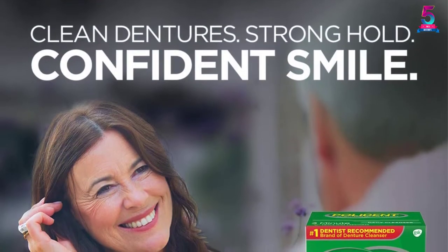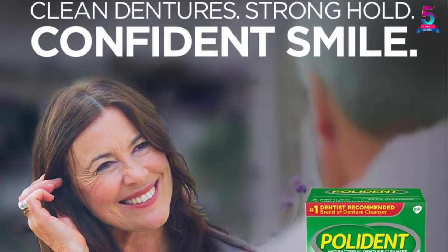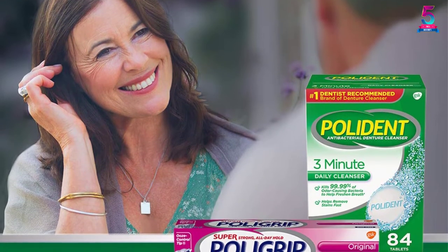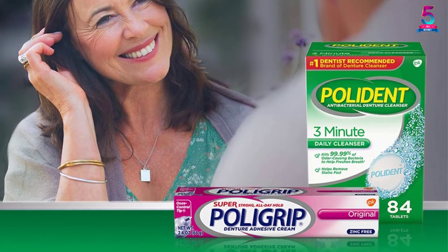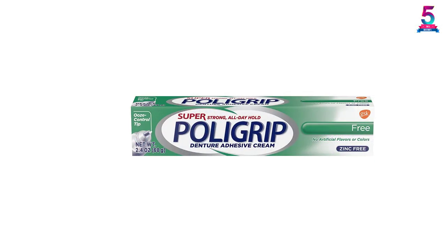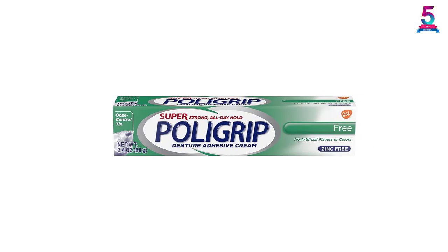It does not matter the type of adhesive you want. The Poly Grip Cream has a variety of formulations to help you maintain better oral health and have a confident smile. When it comes to cleaning needs, use Polydent that kills up to 99.99% of the bacteria that causes plaque.